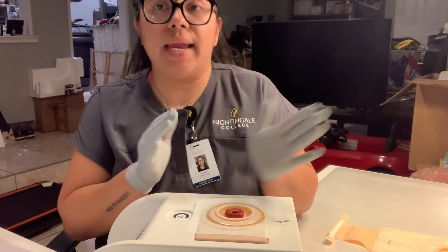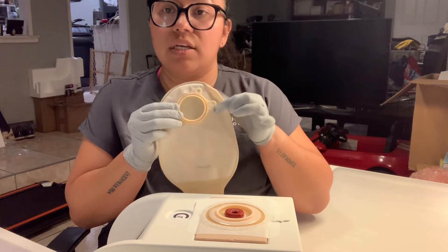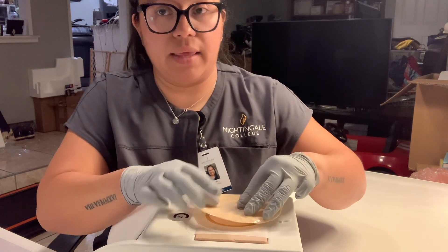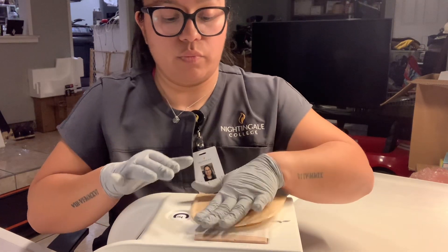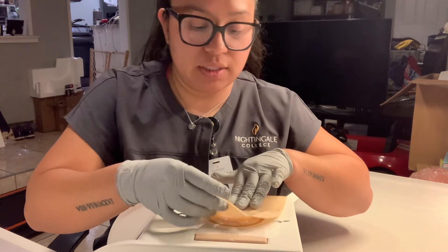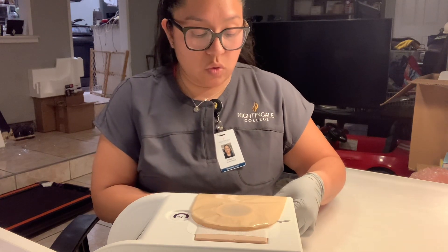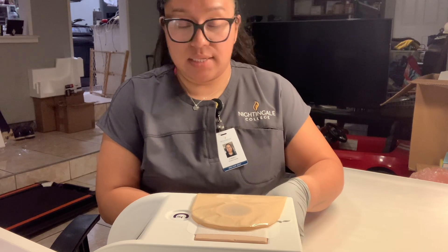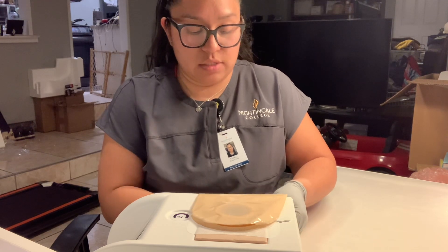I'm going to go ahead and now apply my new colostomy bag. The colostomy bag is going to make that snapping sound, so we want to make sure that we hear the snapping sound when we apply the bag to the plate. I want to physically see that it's in place. From here, we want to make sure that we close the bag from the bottom so that Mr. Conde does not have an accident if we were to leave the bag open. So now it's closed — it's officially closed.